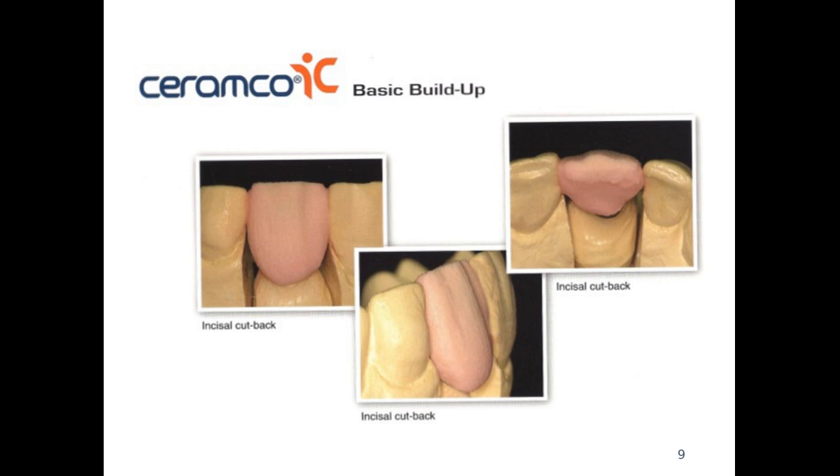For the cutback, if we need to build up mamelons it is also good to cut back a little bit of the dentin porcelain for the application of the incisal. If we look at the surface of our incisor teeth, we can see that in some areas our teeth are a little more translucent and others are more opaque, creating that natural flow of how the tooth looks.